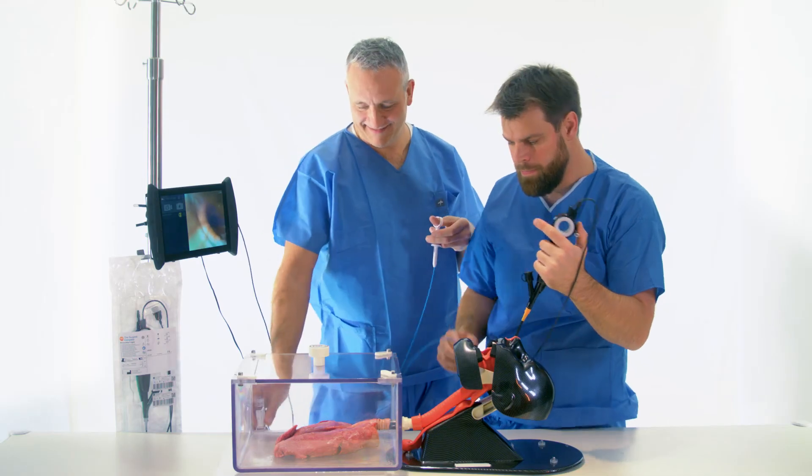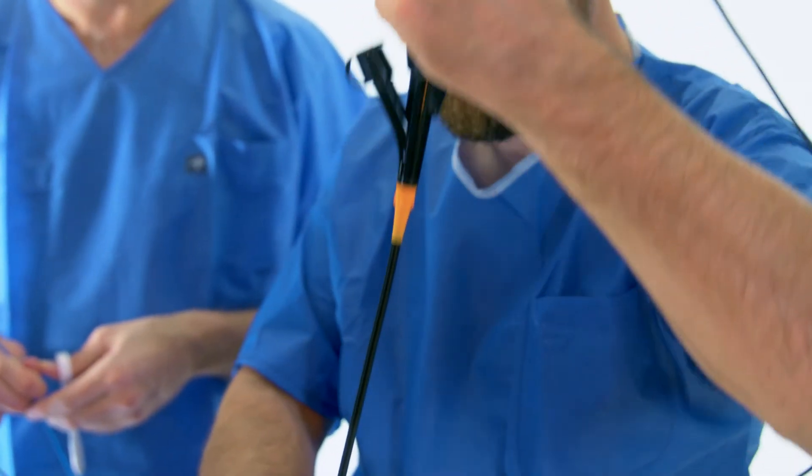After the procedure, the bronchoscope is removed while taking care to release the bending.